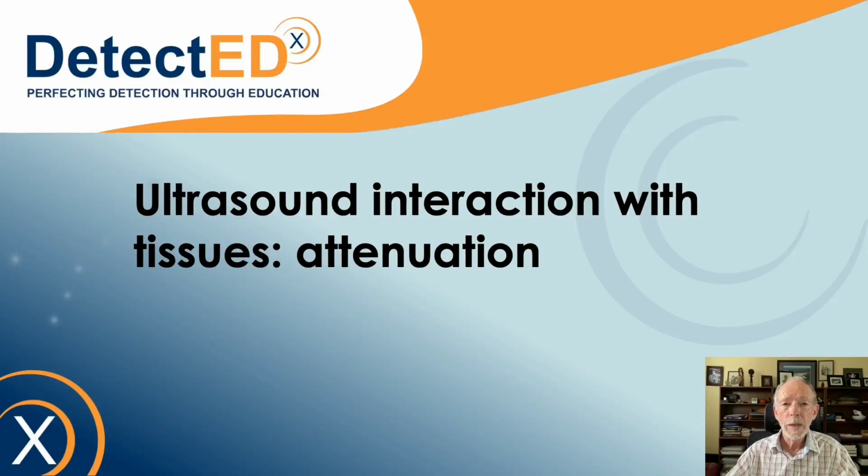Hello. In this and the following two presentations, we'll be taking a look at the most important interactions of ultrasound with soft tissues. We'll start with attenuation, which means the weakening of the strength of the ultrasound as it travels through the tissues, because it's a major limitation of ultrasound. It basically dictates what frequencies we can use and therefore what resolution we can achieve.